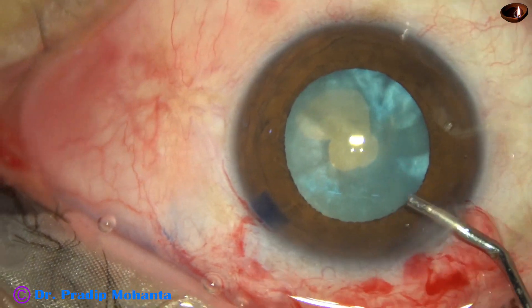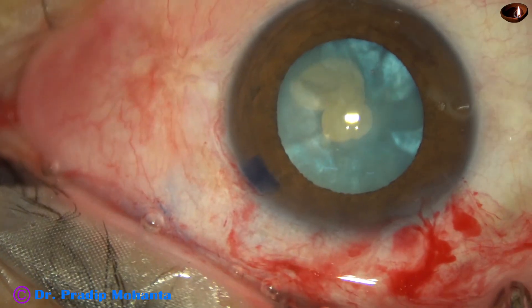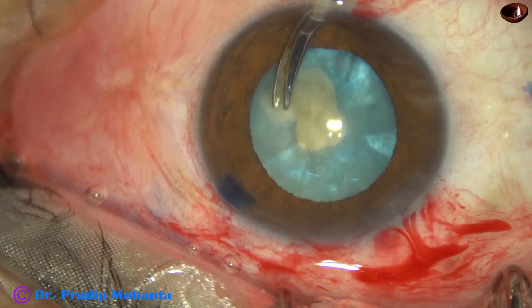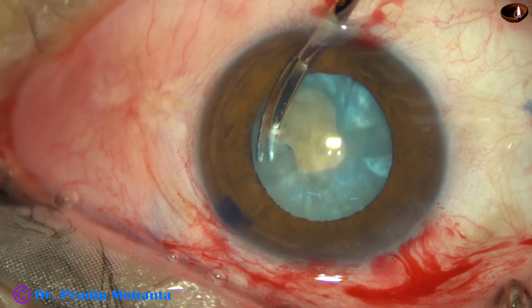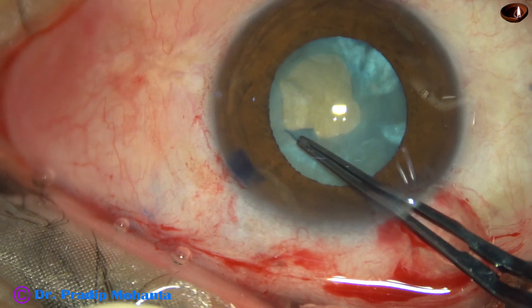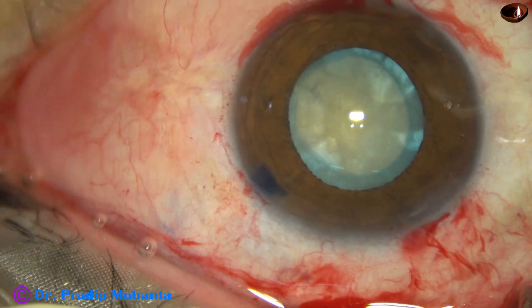Immediately I plan to cut this fibrous tissue along with the anterior capsule. So I make a side port, about 2 mm wide side port at 6 o'clock. Take a vitreous micro-scissor and cut the fibrous sheet along with the anterior capsule here. And now I take the utrata again, and I find that the rhexis is becoming easy now. Nice rhexis.